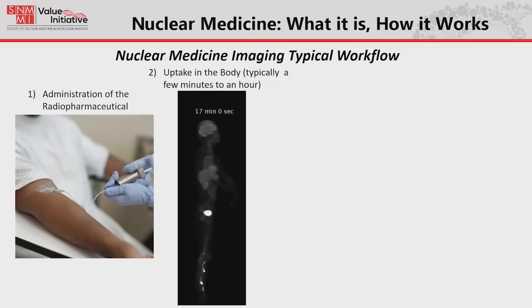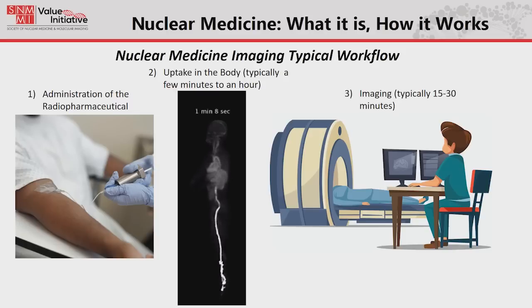You can see the kidney has actually filtered out and the bladder's filling up. You can see all this over time. It's the first time we've ever been able to see what an injection does all at once, let alone what FDG does. So we can get full pharmacokinetics of all of these things now with this new device. A PET scanner, but 2 meters long. Very cool.